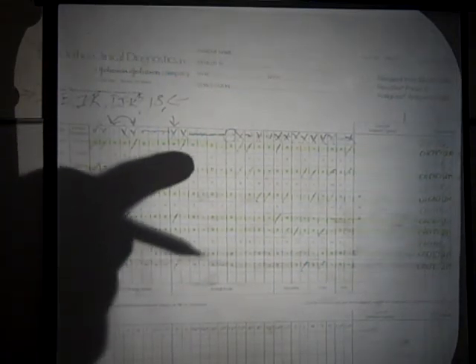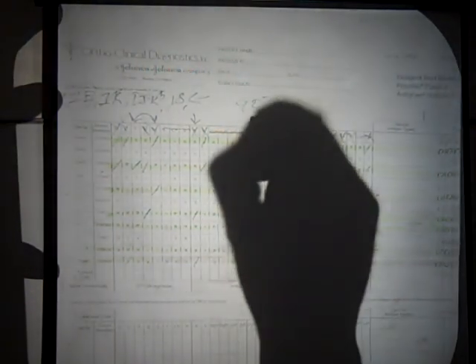And if we look at our A panel, I believe that we match that criteria. Here we have 1, 2, 3 negative reacting cell lines, and here we have 1, 2, 3 positive reacting cell lines. So after we find that big E on our B panel, we are at the 95% confidence interval that this patient has Duffy A antibody.